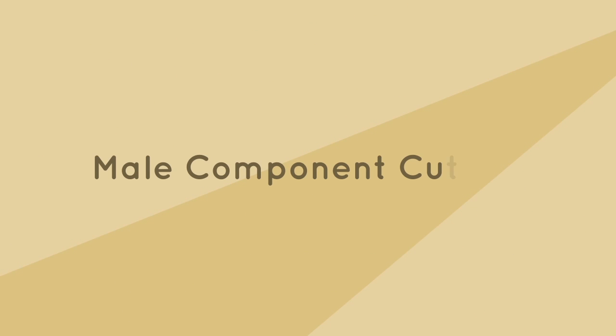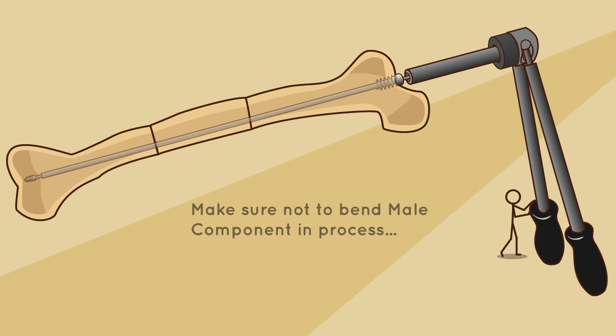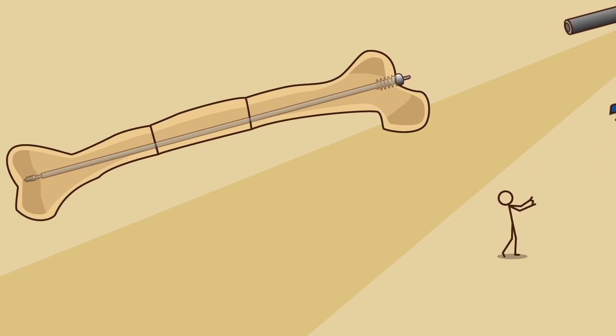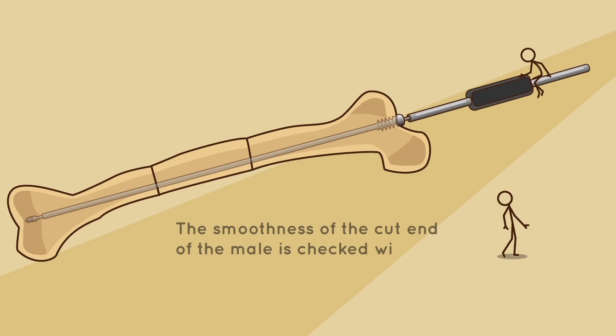Male component cutting. The male component is cut with the male cutter MC-200, making sure not to bend the male component in the process. The smoothness of the cut end of the male is checked with the probe of appropriate size.